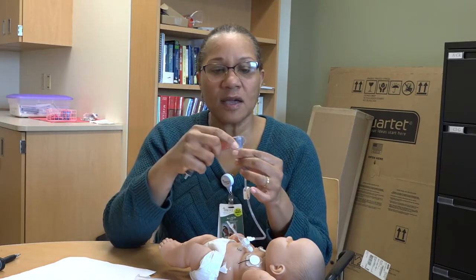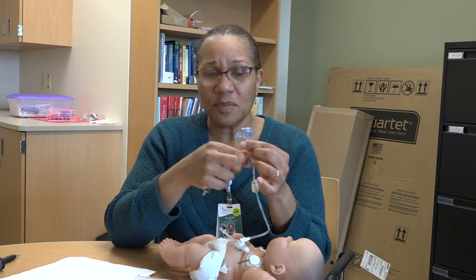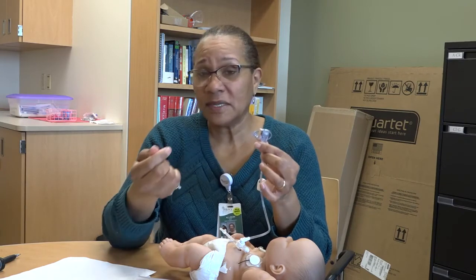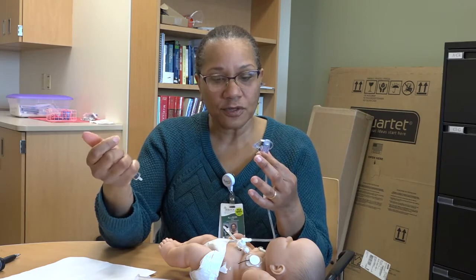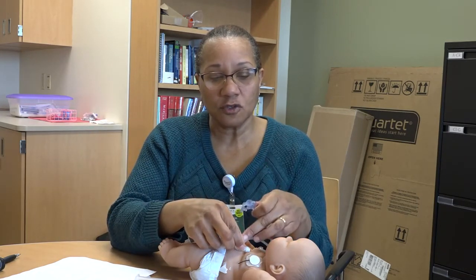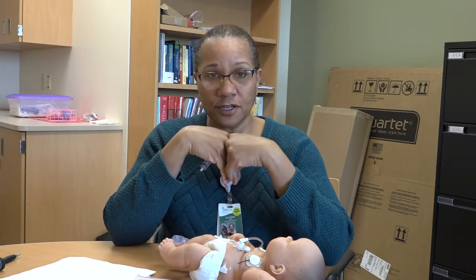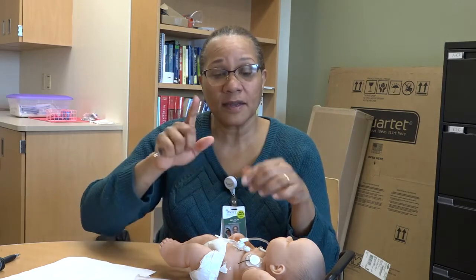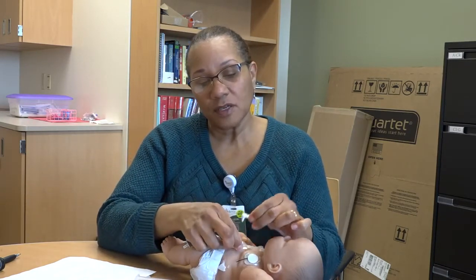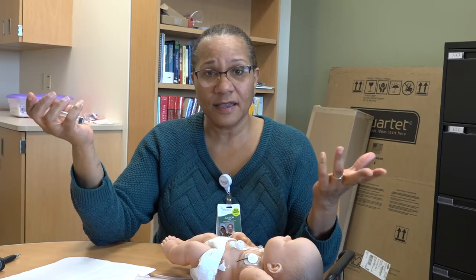what medications may cause what we call precipitation, or it can cause the medication to harden with being mixed with that formula, and then the baby doesn't get the medication, plus you might cause some tube blockage. So don't mix them together, give them individually, flush with water in between, flush with water afterwards. Once again, that's helping to keep the G-tube clean, keeping that anti-reflux valve nice and clean so that those two portions stay flushed together, so that it decreases the chance of any gastric formula coming back and up out through the tube.